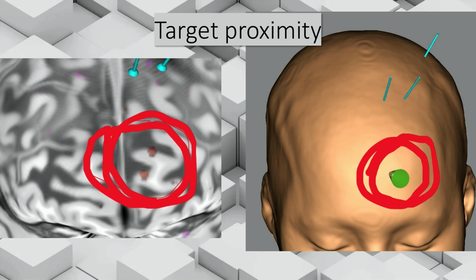Especially in the context of TMS fMRI. So what happens in a TMS fMRI experiment? The participant comes in, they get a 2-hour battery of symptom assessments. They come in for a baseline scan. You've already wasted an enormous amount of time and money getting that person enrolled in your study, and then they come in for the TMS fMRI session, and then all of a sudden they're like, nope, that target's not good. I'm not going to let you stimulate me there. If you don't have a backup target, you throw away all their data. You don't have any TMS fMRI data. You don't enroll them in your clinical study, whatever. So that's problematic. So having a backup target could pay off for you.